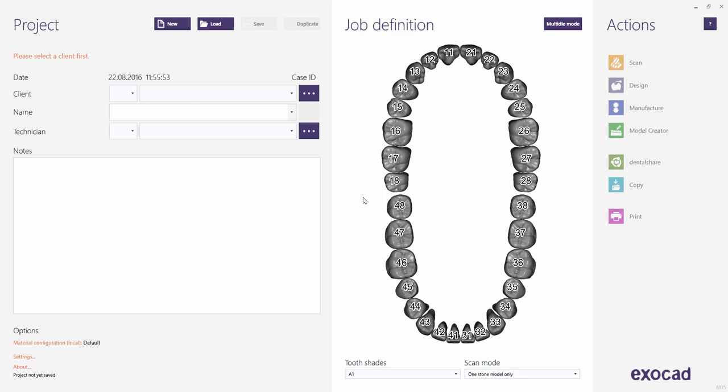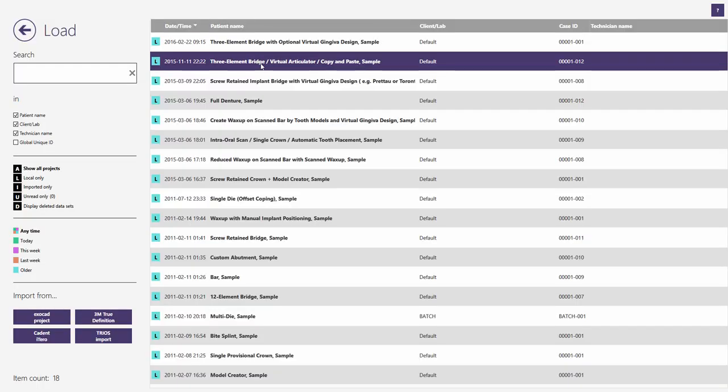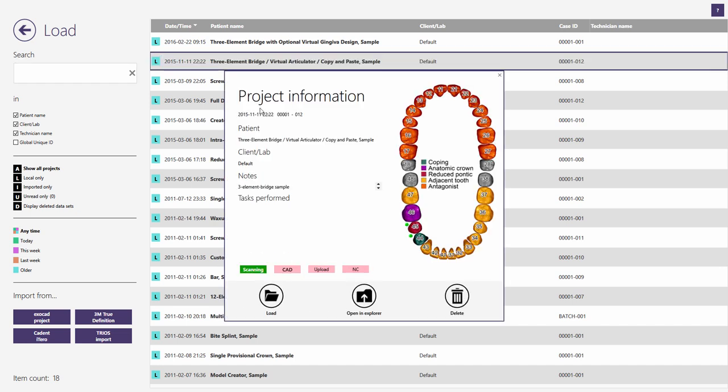This video tutorial from ExoCAD will show you how you can quickly design a three-element bridge. To start, run the DentalDB application. Note that there is a separate tutorial showing you how to set up new cases in the DentalDB. For this tutorial, we load an already existing sample case instead. Click the Load button at the top of the DentalDB. Select the demo sample called Three Element Bridge Virtual Articulator Copy and Paste Sample and click the Load button again.